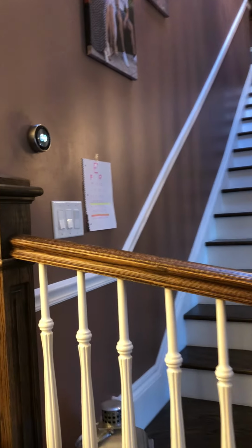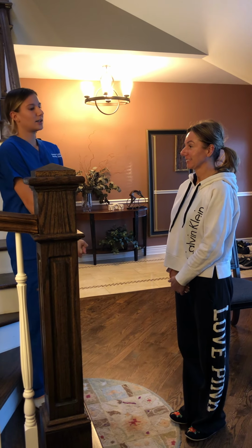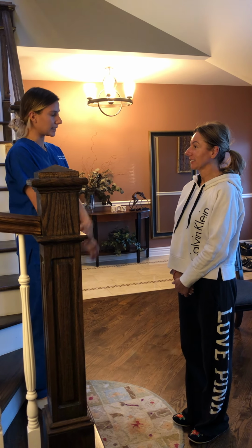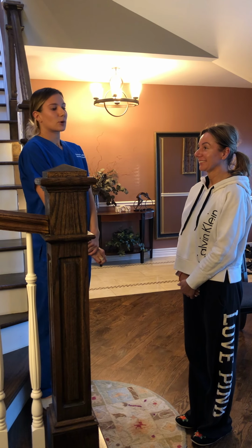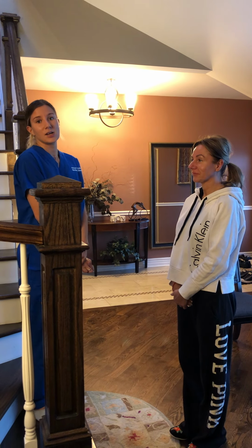So first we're going to test our visual acuity, which is testing cranial nerve number 2, and we're going to do that with our Snellen eye chart. So, before I do that, actually I want to ask my patient a few questions. First question, have you been experiencing any trouble seeing or any blurriness? No. Okay. Next question, have you been experiencing any eye pain? No. Okay. So, we're going to continue with our Snellen eye test.